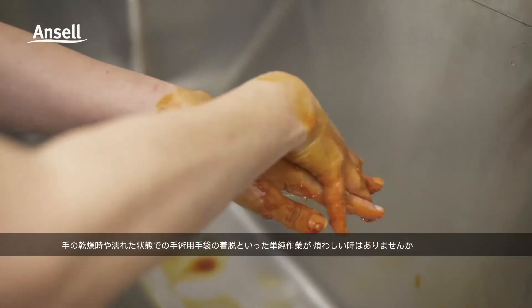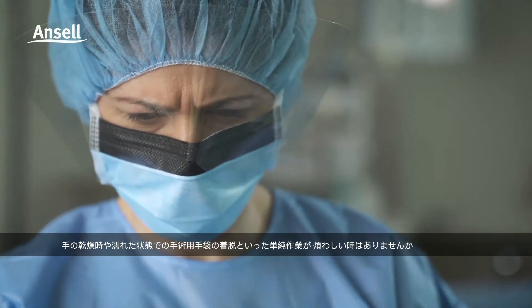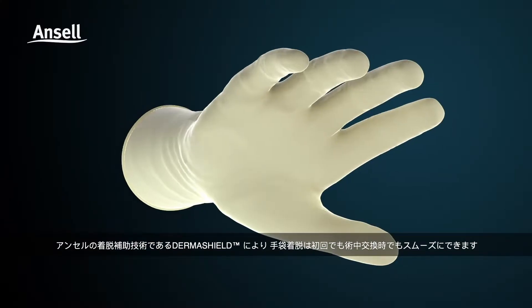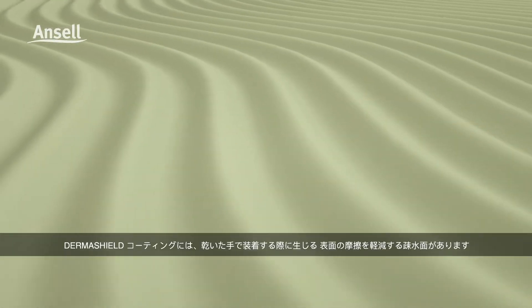Often simple things like donning surgical gloves with dry or damp hands can be frustrating, whether it is your first time on or during an intraoperative change. Derma Shield donning aid technology helps make donning effortless.